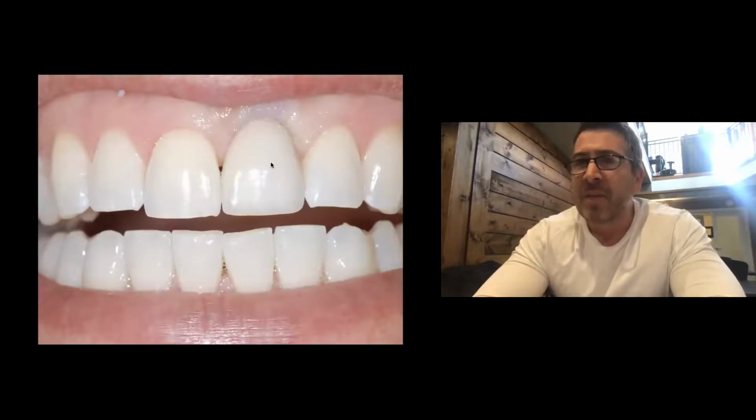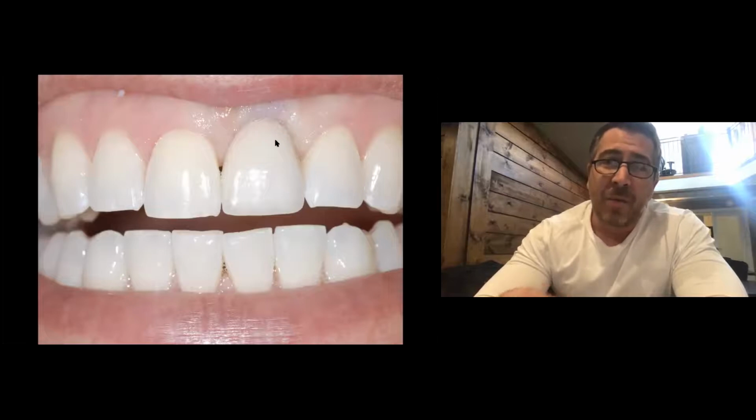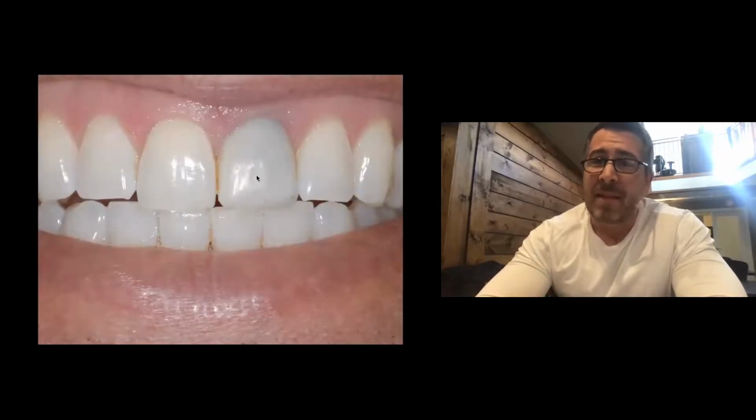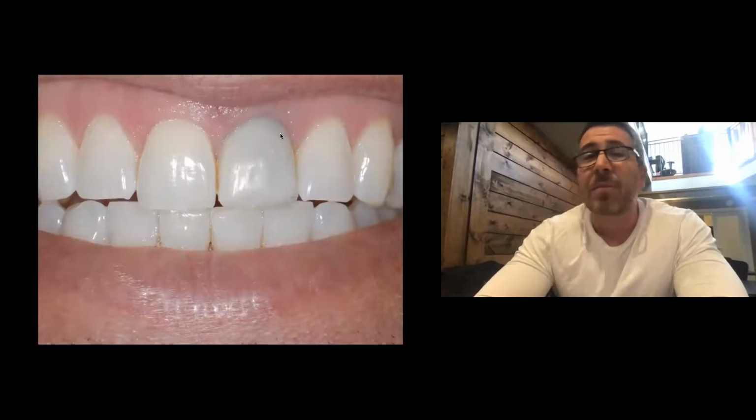This is what the lab sends me. I try the abutment on, I try the crown on. The zenith is too high. So if the zenith is too high, that means the gingival third of that crown and abutment is too contoured. So I take a high speed and I reshape that abutment and I made him a temporary crown. And that's my temporary crown. It's not the nicest temporary crown, but the point is to show you that by changing the shape of the abutment and the crown, that's the same case. The tissue looks completely different.